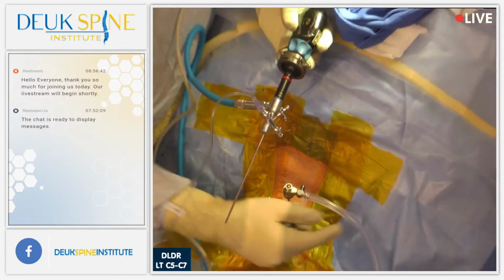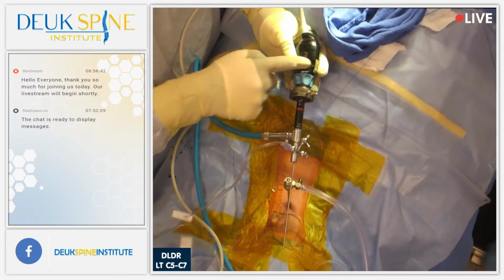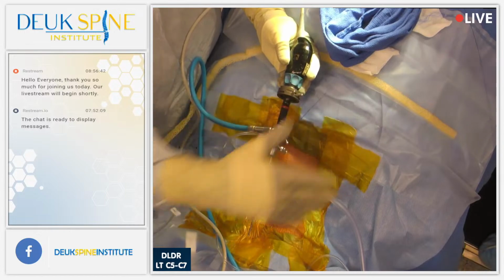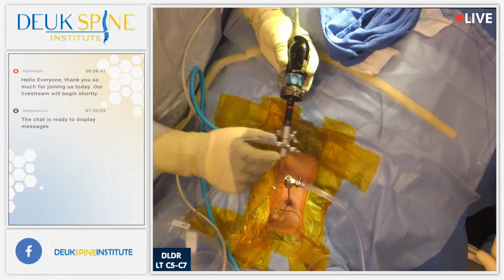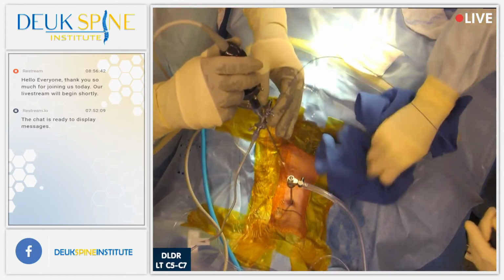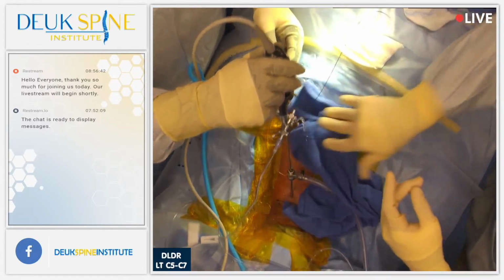This is a suction line. This is the light source, the camera. This is the endoscope. This is the laser fiber. This is the irrigation. And this is cold irrigation. Hope you enjoy watching the surgery.